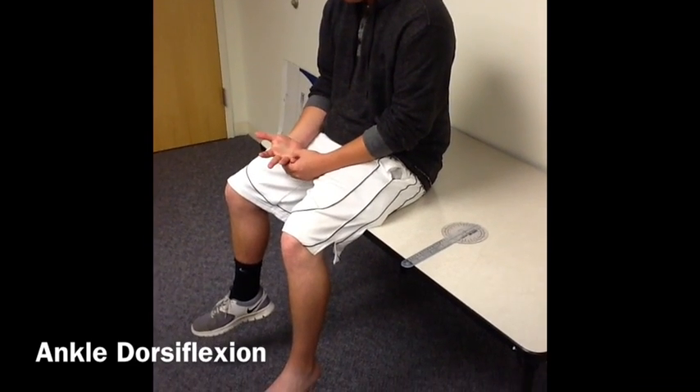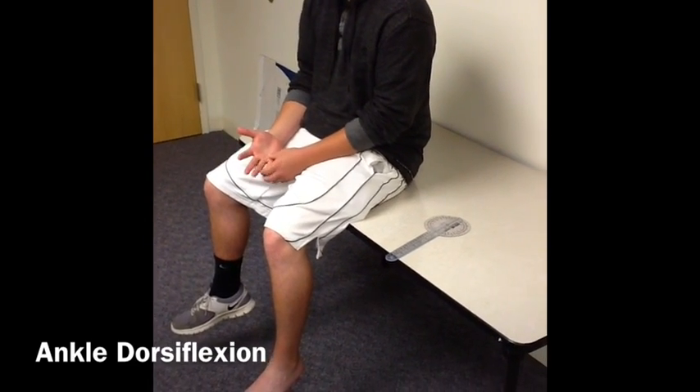We will be teaching ankle goniometry. For this test, you will need a goniometer and a patient.